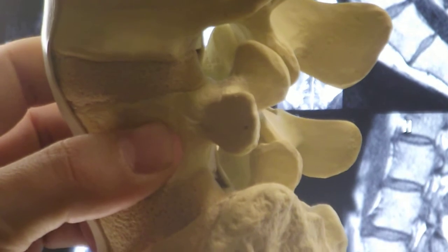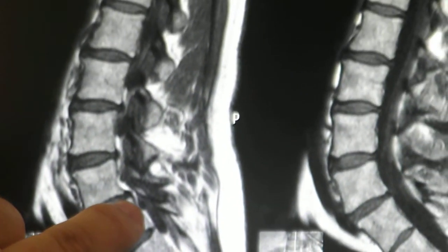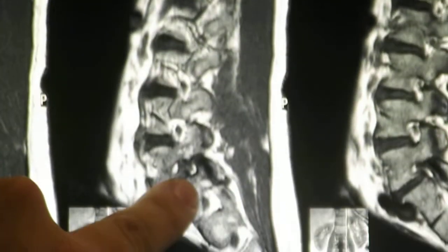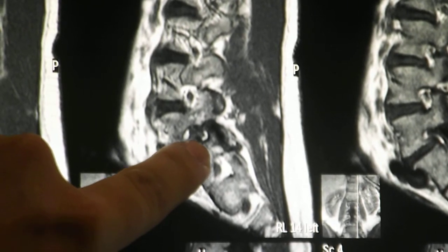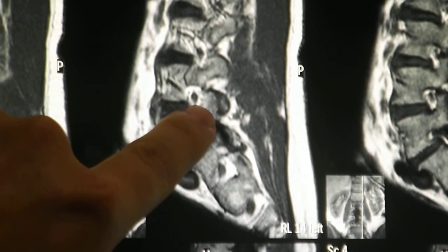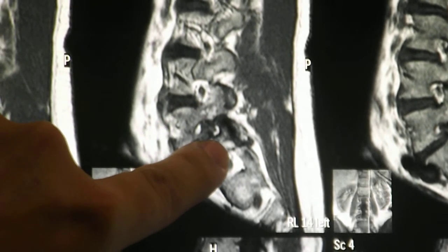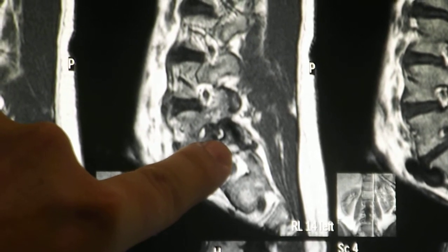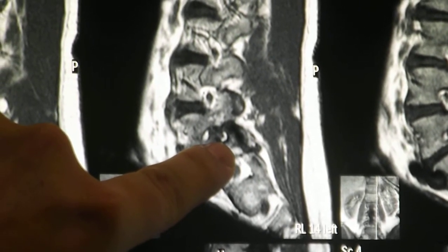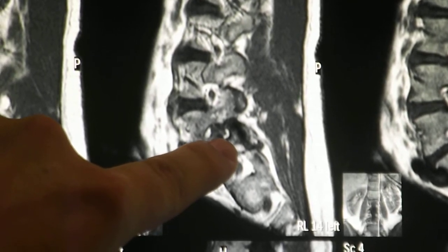And if we look over here, we're looking at the spine sideways, just like this. This is called a sagittal view of the spine. You can see a pretty good view of that disc. But if you go right up in here, this is actually supposed to be nice and clear and white. It's supposed to be full of water, with a little black spot in the middle with our nerve root coming out here. But as you can see, there's her L5-S1. That's the disc actually impeding or creating spinal stenosis in there. So she's got a bulging disc that's actually causing spinal stenosis.